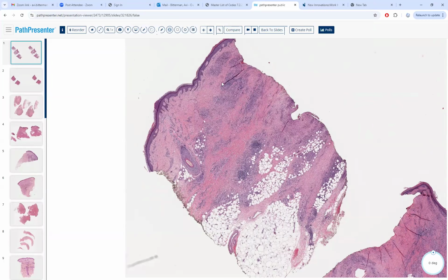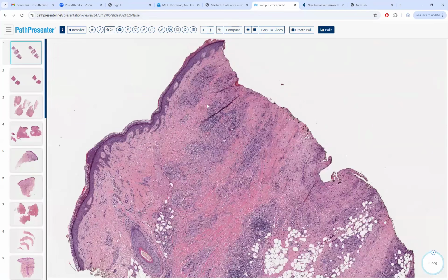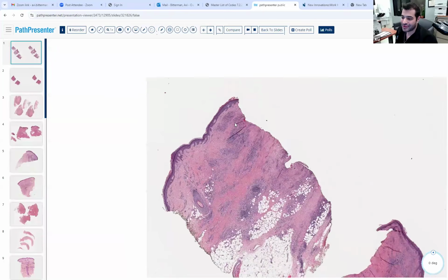You can see some focalized concentrations of these histiocytes a little bit deeper down. Usually NLD also falls under a square biopsy pattern. The actual punch itself looks very angulated and square. So you've got a square biopsy.